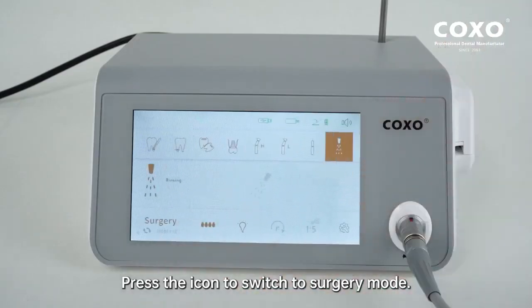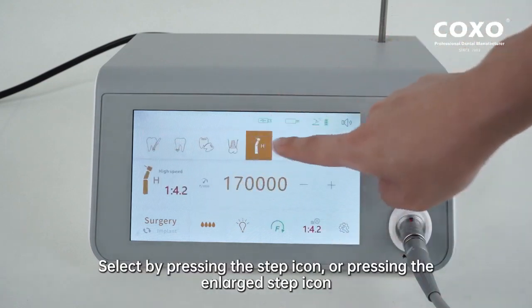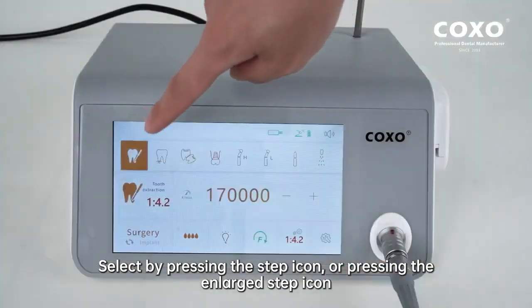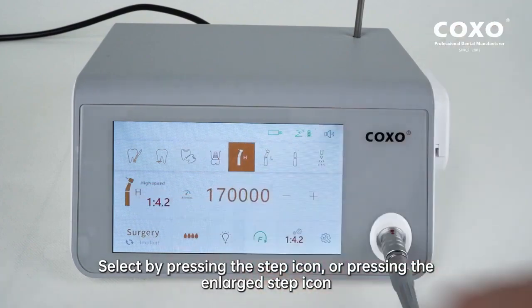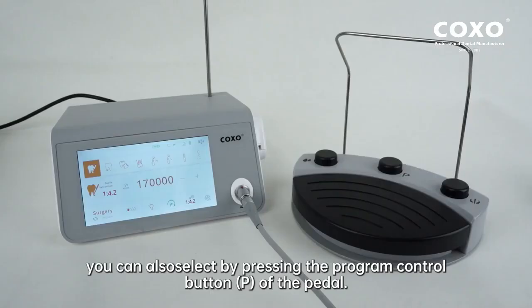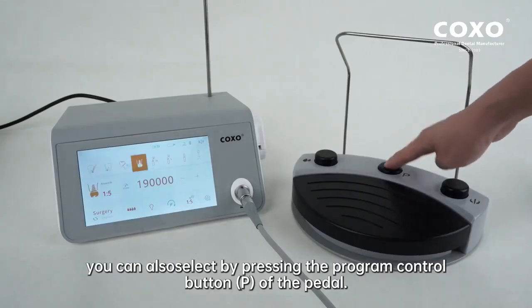Surgery mode. Press the icon to switch to surgery mode. Select by pressing the step icon or pressing the enlarged step icon. You can also select by pressing the program control button P of the pedal.